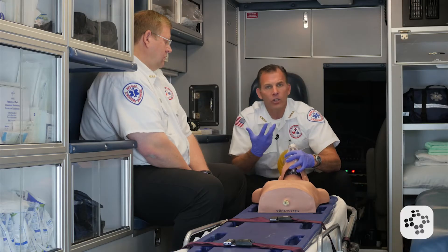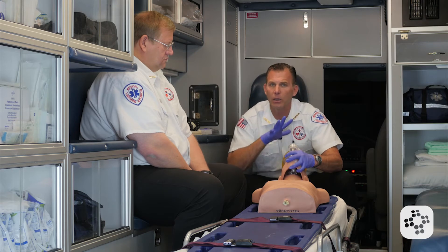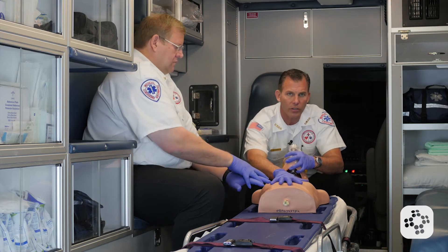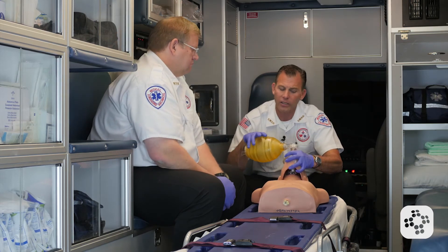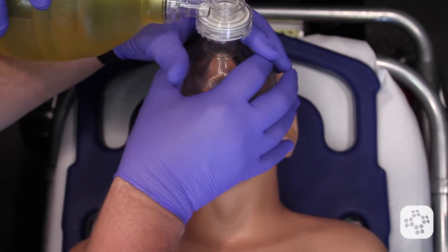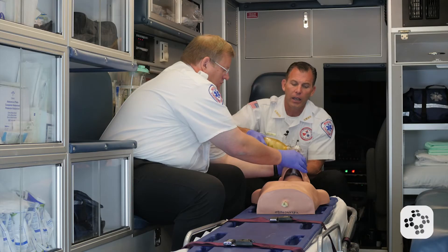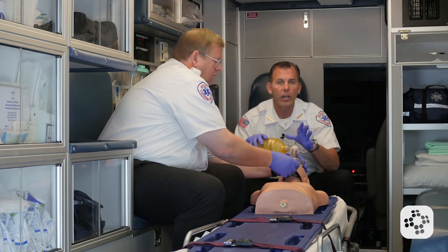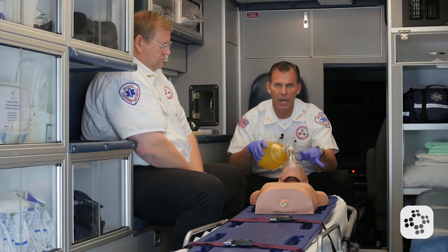There can be facial features — external, internal, or traumatic — that cause problems with sealing the mask. If we have a second rescuer, we can incorporate them. For example: 'Jody, I'm having a hard time getting a good seal — could you seal the mask while I concentrate on squeezing the bag?' He can use two hands to seal the mask, and when he confirms he has it, I squeeze the bag. I should see a chest rise and fall. If there is no chest rise and fall, that air did not go in — no matter how much we want it to. No chest rise, no chest fall means we did not give the patient a breath.